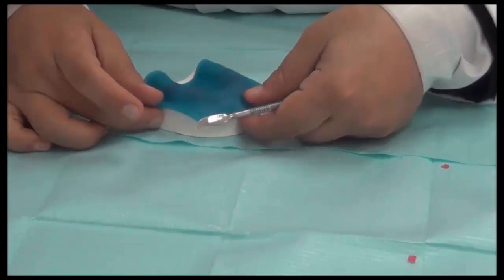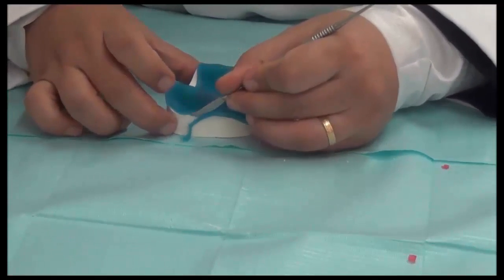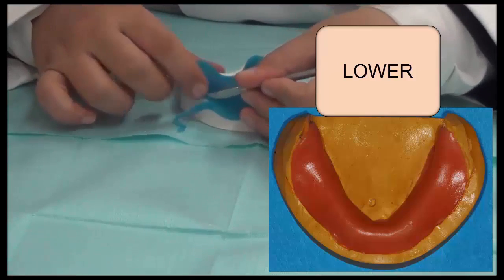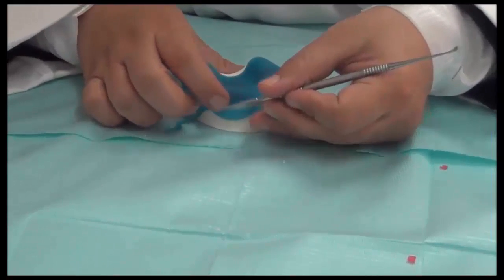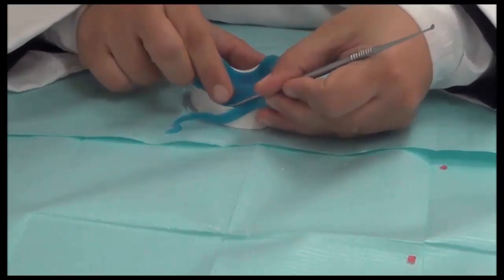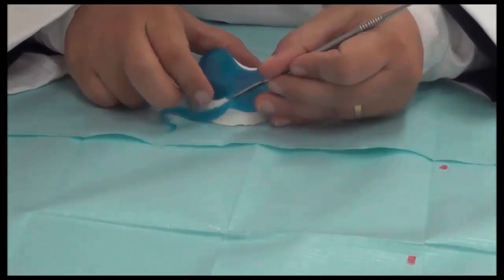If it becomes difficult, we could simply remove the excess of the material from the outside of the land area, from the outside of the cast. I have adapted it as much as possible. The material is going over the sulcus. This is the exposed sulcus I have adapted it to. But over the land area, I just remove the excess. So fully adapted as much as possible, and then remove the excess.